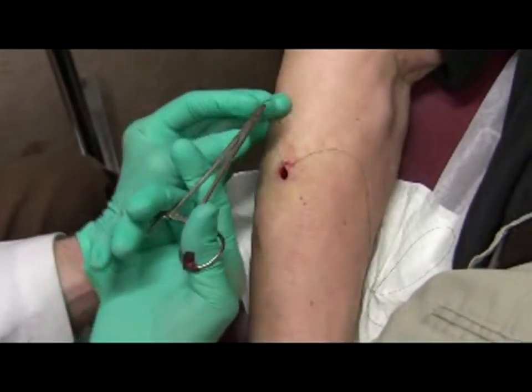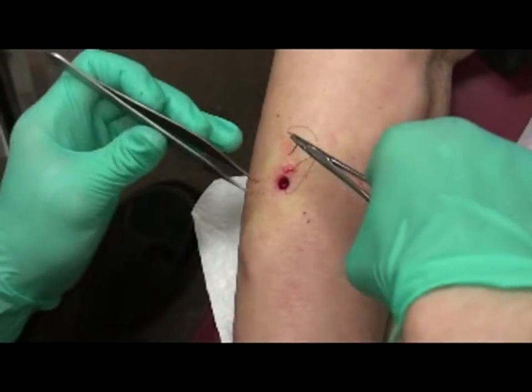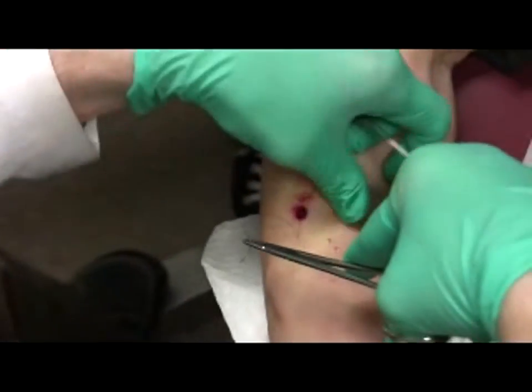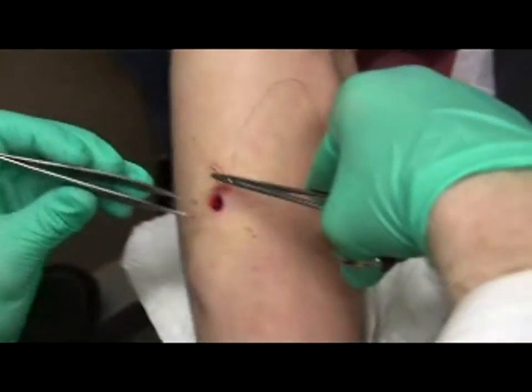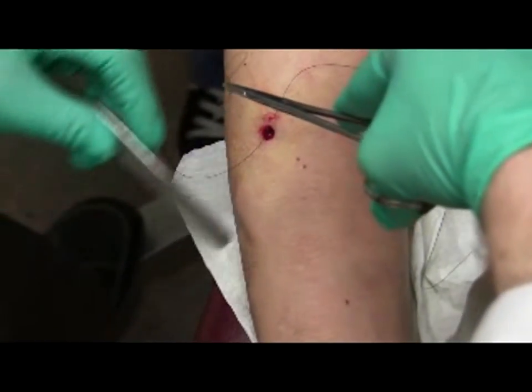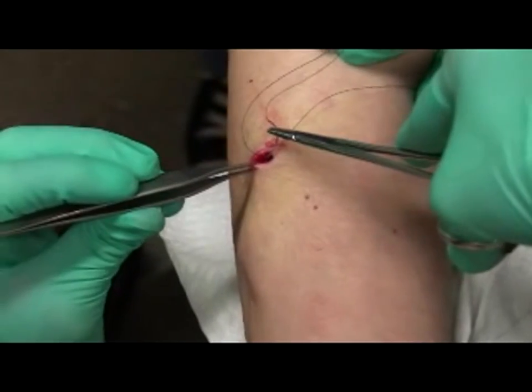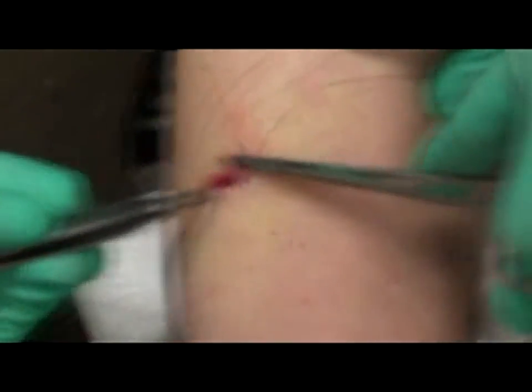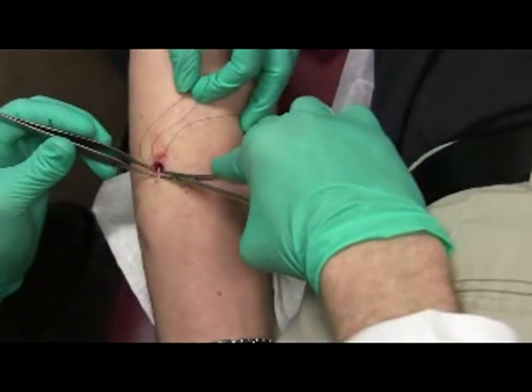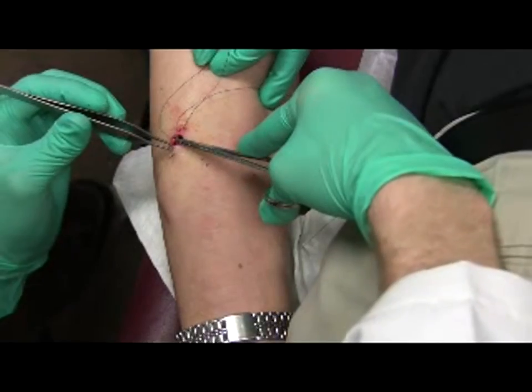Grab the contralateral wound edge with the forceps. Twist the edge toward the skin and away from the defect. Some people like to keep the amount of string here very short, which keeps it automatically out of your way. If you accidentally pull it the wrong way and it gets in the way, your assistant can hold the string back while you continue. Insert the needle as previously — making it perpendicular to the wound again. Push the needle through the skin, resting your right fourth finger on the skin. Once the skin gives, the needle does not penetrate out of control.